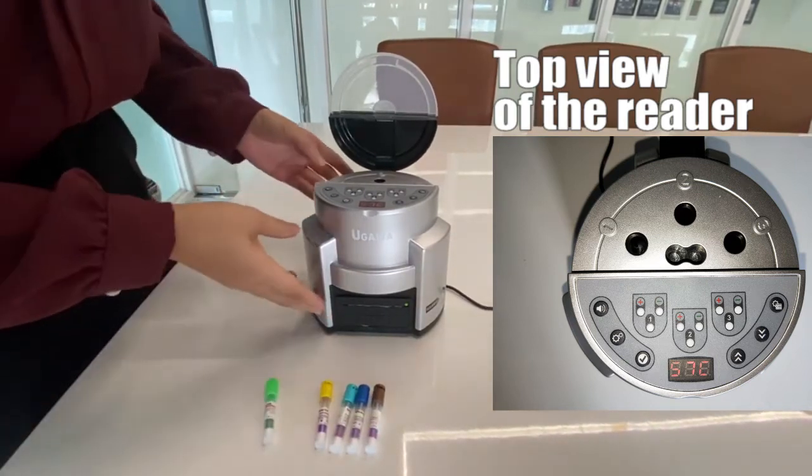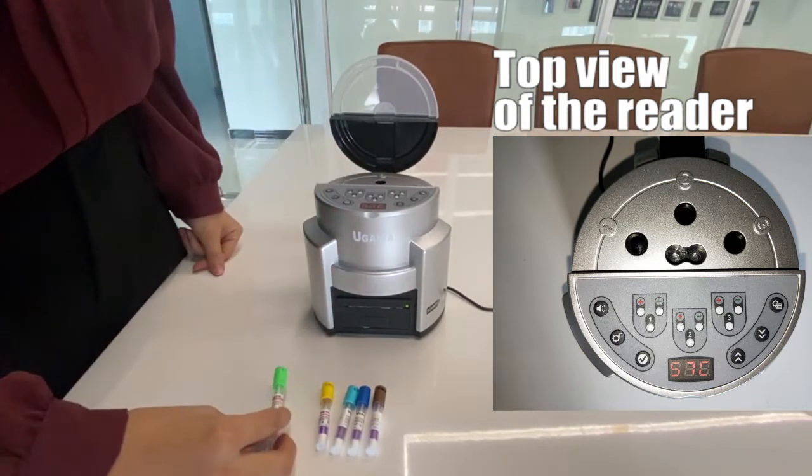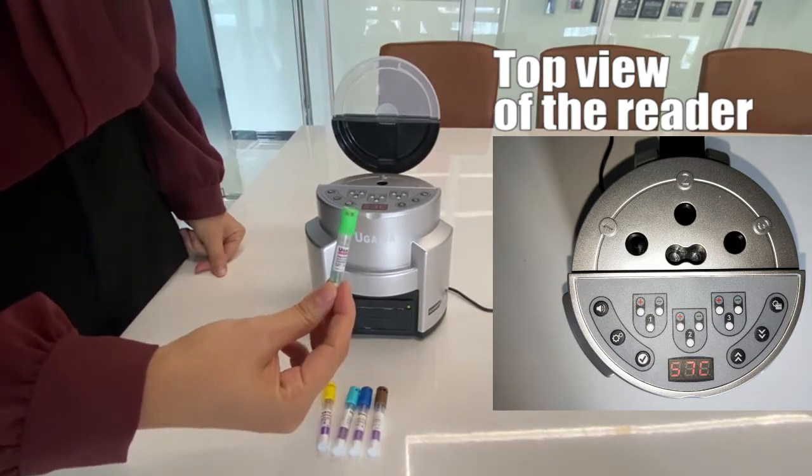The other mode is 37 degrees centigrade. It's for incubating ethylene oxide BI. It is a four-hour BI.